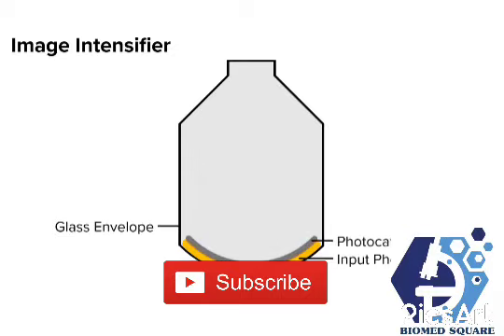3, just like in our X-ray tubes, there's a cathode side and an anode side. Here, the photocathode layer acts as a photodiode and converts light into electrons. 4, the anode is a circular plate with a hole in the middle. Electrons will pass through this hole and hit the output phosphor.